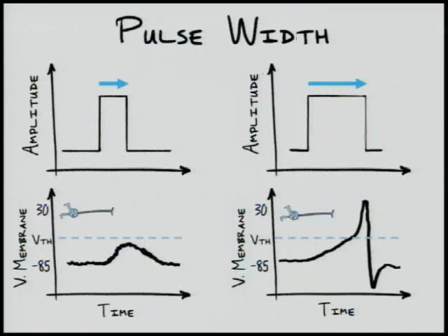Pulse width is another parameter of neurostimulation that can be adjusted. Increasing pulse width also generally increases nerve recruitment, or the number of nerves being stimulated. It does not, however, increase the area over which stimulation occurs. Again, going by the pump analogy, increasing pulse width is like increasing the time the pump is left on. In other words, pulse width is the time the neurostimulator pumps out charge. With regard to recruitment, pulse width generally is used to stimulate more nerves in a given area. This area is more or less determined by amplitude, which we discussed previously.